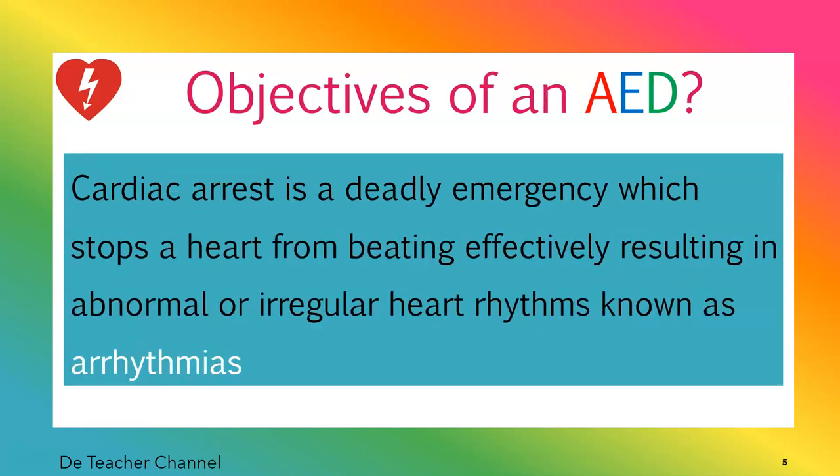Objective of an AED. Before I give the key objective of using an AED, let me give a bit of background. Cardiac arrest is actually what brings in AED. Without cardiac arrest, I don't think anybody should be talking about AED.